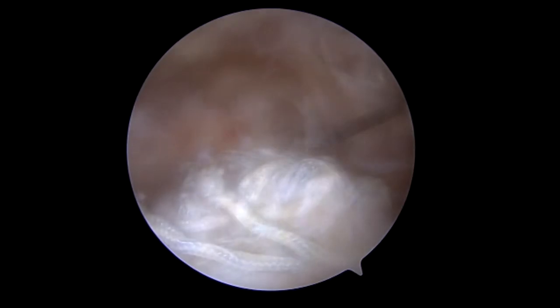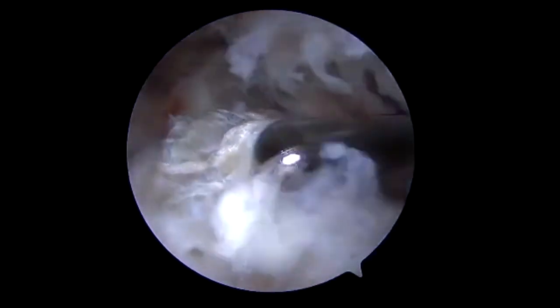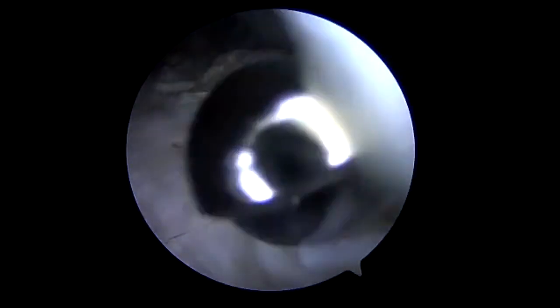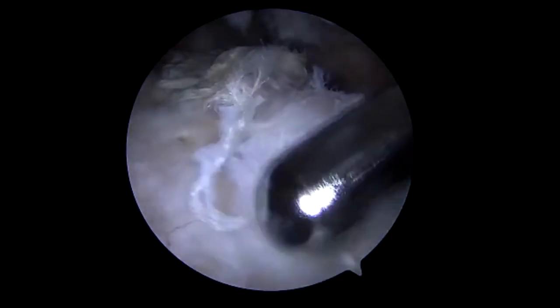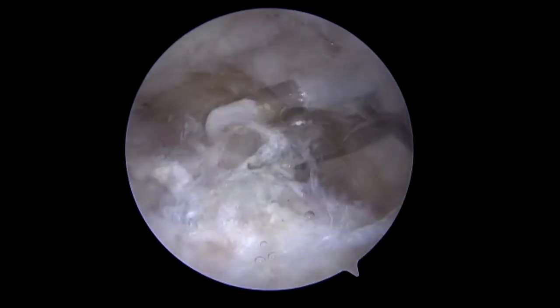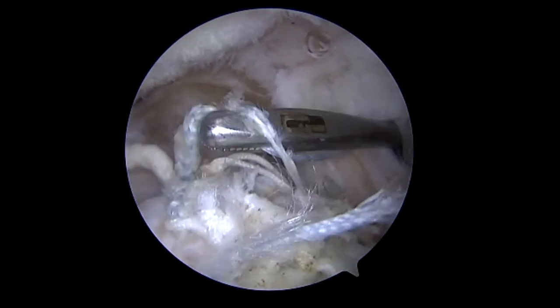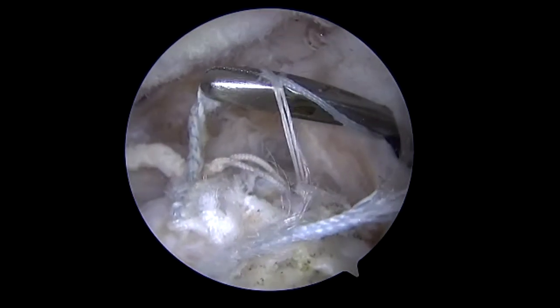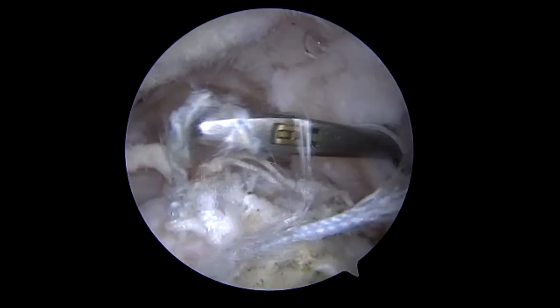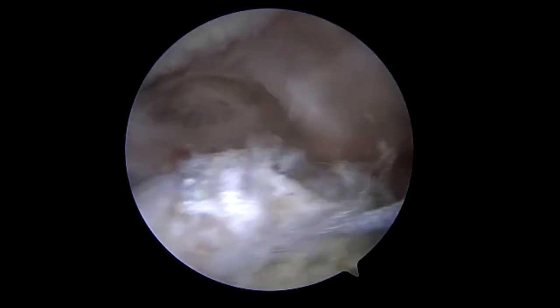A direct lateral portal is made here, and we will begin to debride the greater tuberosity in preparation for the attachment of the most lateral aspect of the dermal allograft, which we'll use to reconstruct the superior capsule. Multiple sutures are being removed as we wanted to delineate the area of good subchondral bone where we will be inserting the anchors, essentially avoiding the locations of previous anchors for the failed cuff repair.